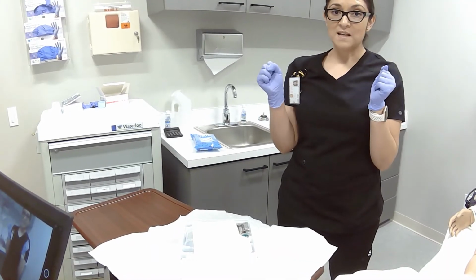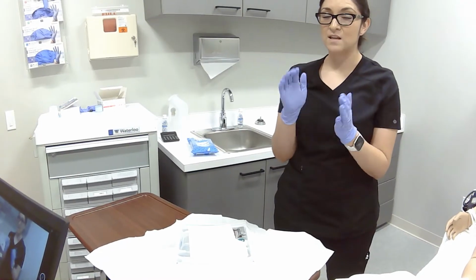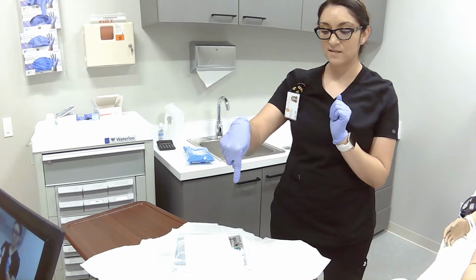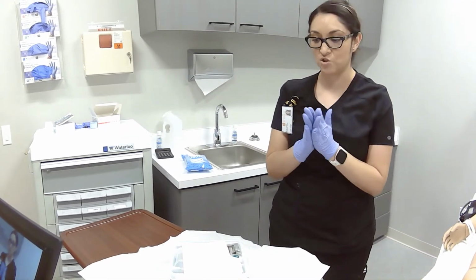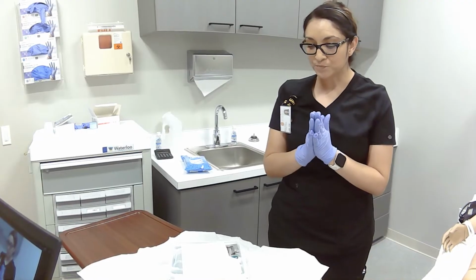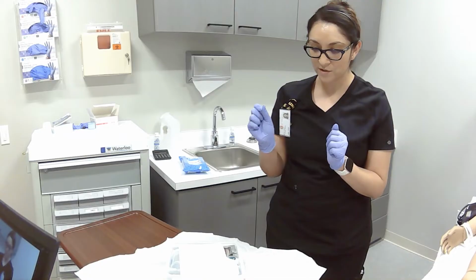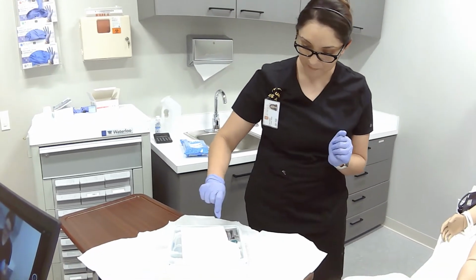So for this next piece, I am still not sterile, okay? However, when you're touching this next drape, you need to be as sterile as possible, observing your 1-inch margins. So, for this next part, I am going to carefully pick it up.